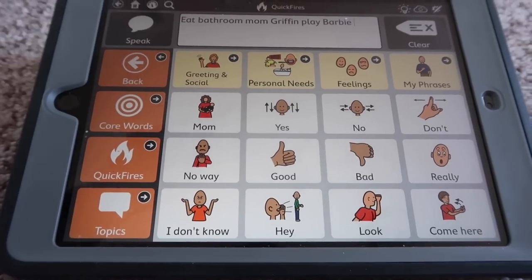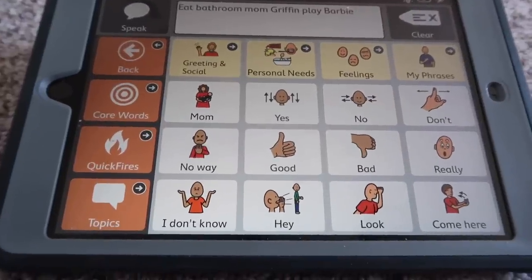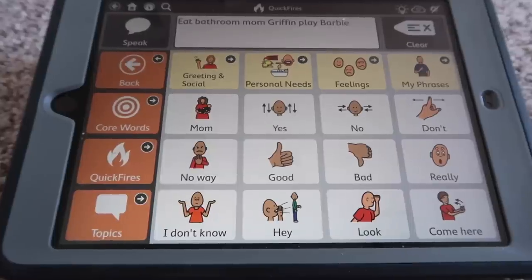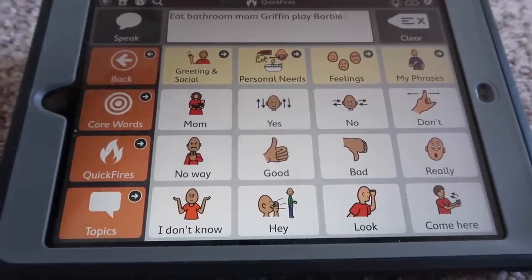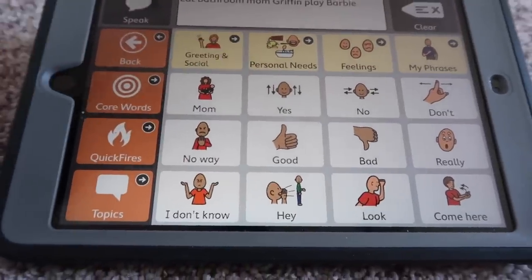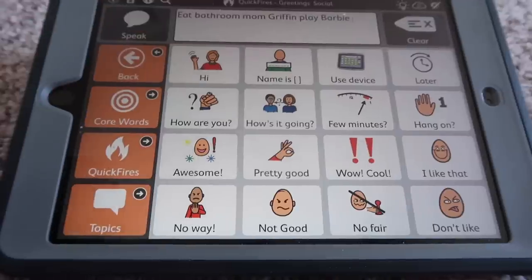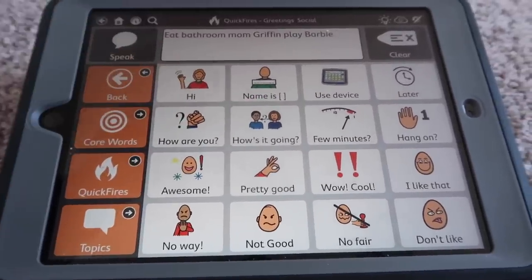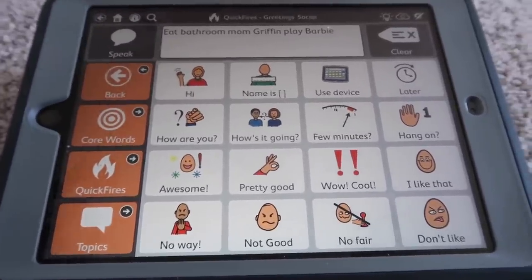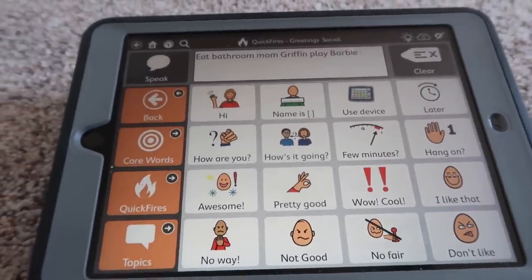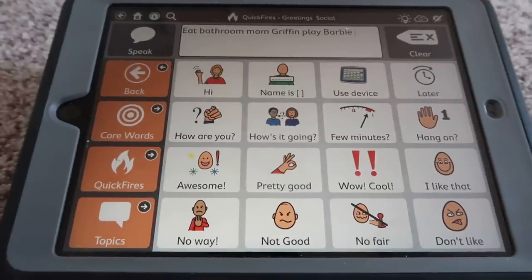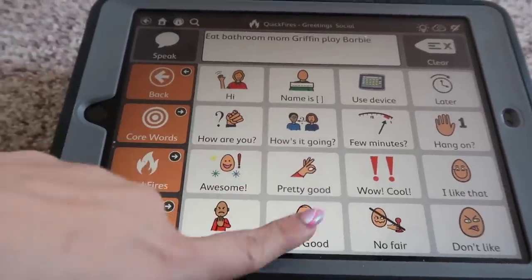Quick fire is just like yes, no — so for things where we just need a yes or no answer, or 'I don't know,' 'no way' — these are for simple communication tasks. We also have greetings like 'hi' and 'how are you,' 'how's it going.' And there are different voices — this was the best English voice that sounded like a young girl's voice, so that's why we picked that one.